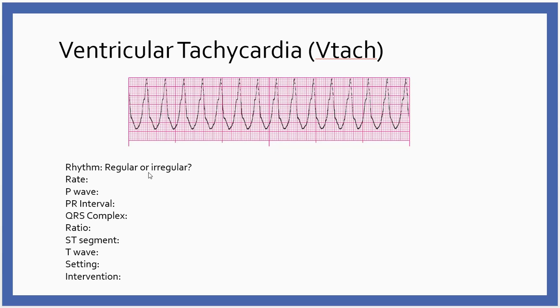If they're dead, Annie, are you okay? Annie's not responsive. Remember, call for help and start chest compressions. Now, this is one of our 2 shockable rhythms. Pulseless VTAC and VFib are shockable. And so you've got to start the compressions, but we need to shock as soon as we can.